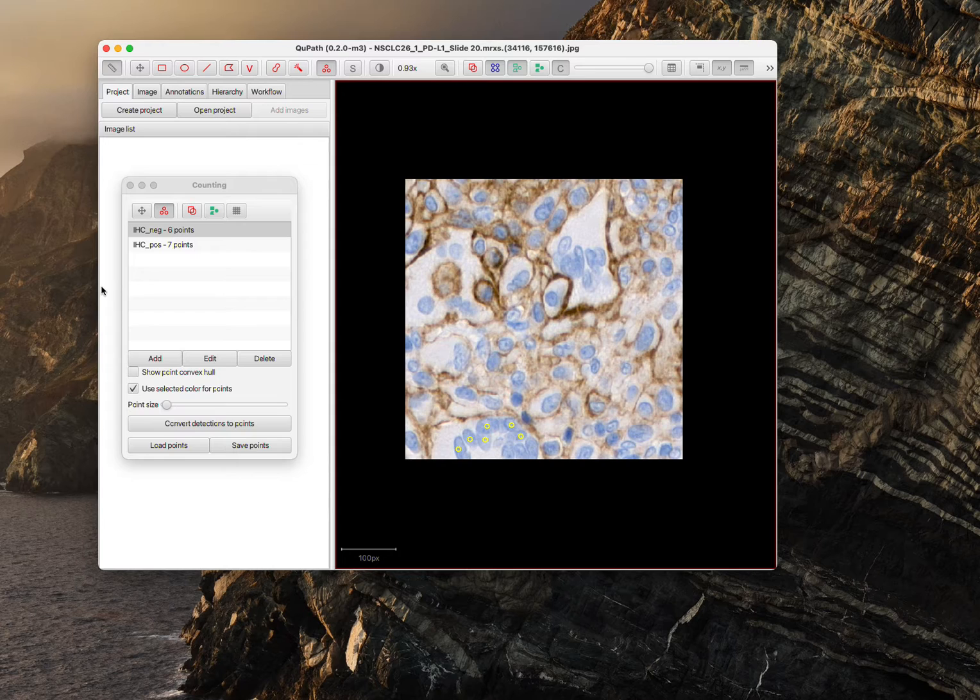If you want to see your previous annotations, you can click this button. You can see all your previous annotations are shown in the correct color, in red. I noticed that if you are annotating your current class, the software will ignore the color setting. It will always show the current annotation as a yellow circle. But if you start to annotate the next class, you can already see that it will be shown in the correct color of blue. Right, so I'll just delete this category.